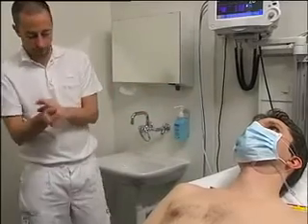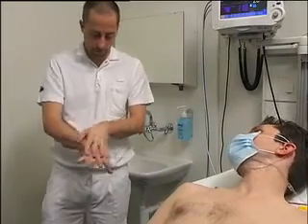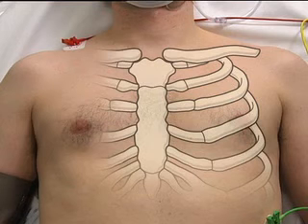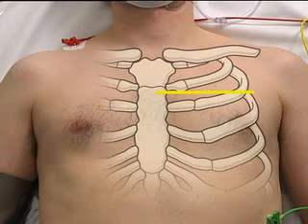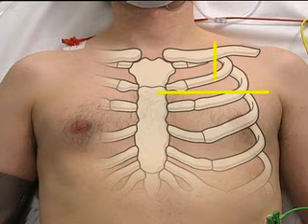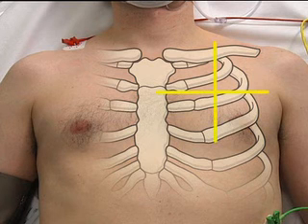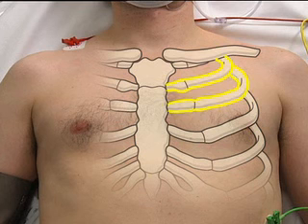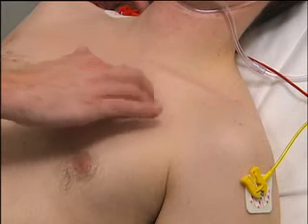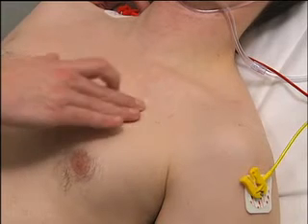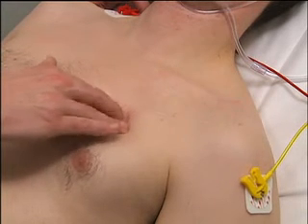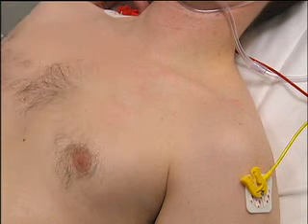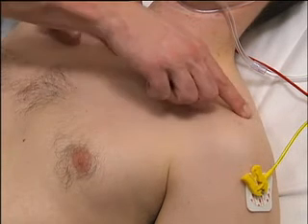Rub your hands with an alcohol-based formulation and then examine the patient to determine the location of landmarks for the procedure. The preferred location for needle placement is the second intercostal space in the mid-clavicular line on the side with the pneumothorax. Begin by locating the second and third ribs. The second rib is the first palpable rib that can be felt just below the collarbone. Then locate the third rib; the second intercostal space is the area between the second and third ribs.